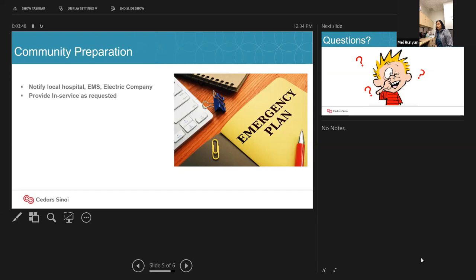If we are unsure, like if they're having a lot of high fills, we will bring a C2 to clinic to assess their right side volume status. During our 120 change outs, for caregivers who haven't had experience with a driver switch out, they will do the switch out at the time of the change out. And really that's it for me as far as discharge. Pretty easy peasy.